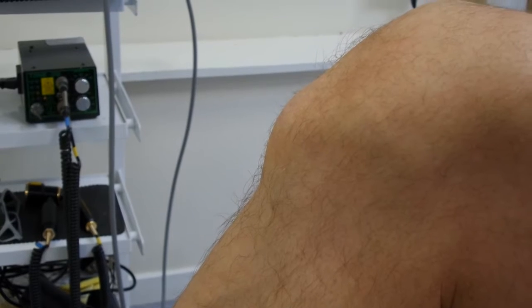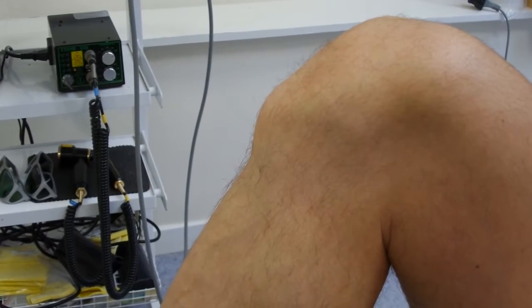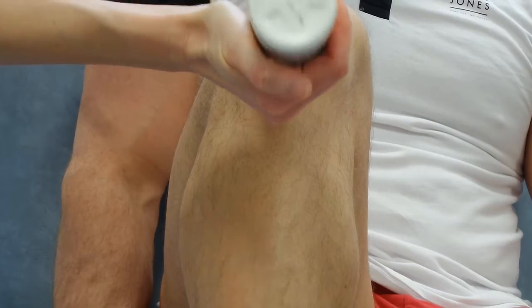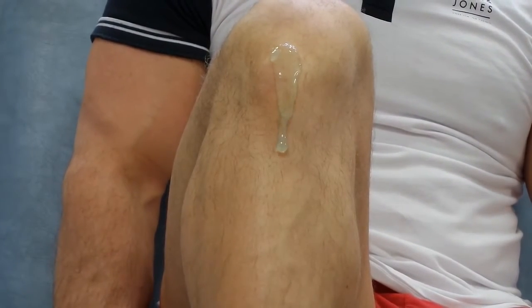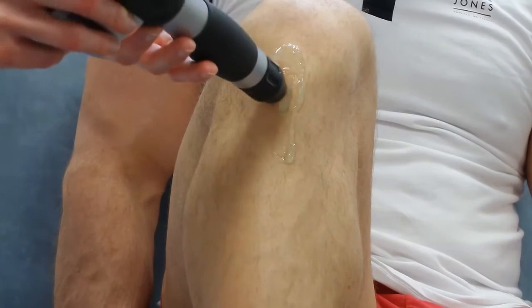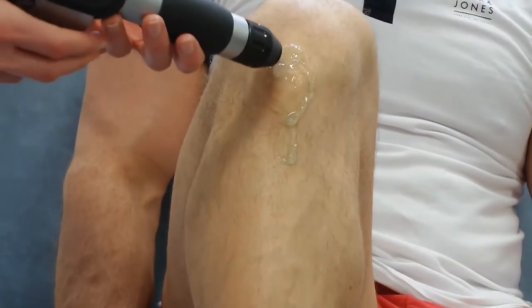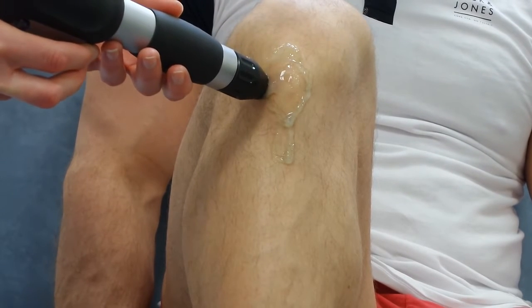You can see the Osgood Schlatters on the knee here. It's quite prominent, a large area of bony formation. You have to emphasise that this is a mature knee. This is not a knee with open growth plates. Apply some gel to the area to be treated, and then bring the shockwave onto the Osgood Schlatters. It's a bony overgrowth at the end of the patella tendon.